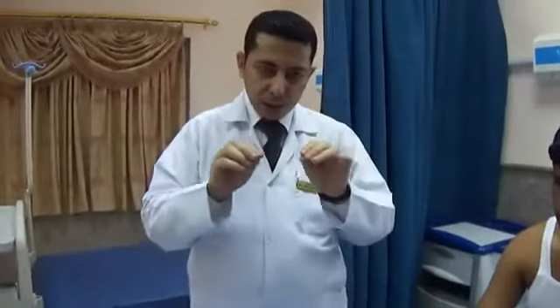Really, we have many methods or many ways in which we can measure the body temperature. First of all is the oral temperature. We have external auditory, we have the forehead, axilla, groin, or even the rectal method. And each way is chosen according to the clinical status of the patient and his age. For example, if the patient is comatose, you cannot check his oral temperature. Instead, you can use his axillary temperature, corrected axillary temperature, or even the rectal temperature. In a patient who is younger than 5 years old, we usually choose the corrected axillary temperature, while if we would like to check his exact body temperature, we check his rectal temperature. All these issues are about the body temperature.